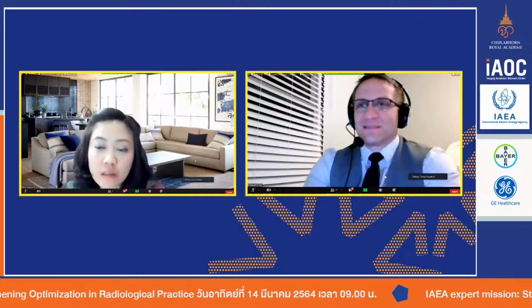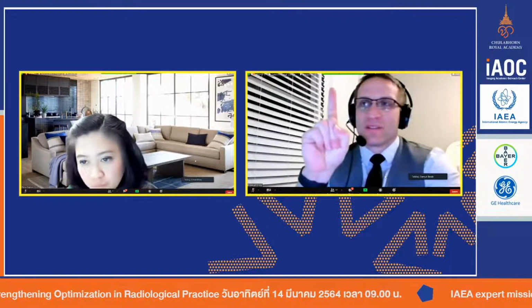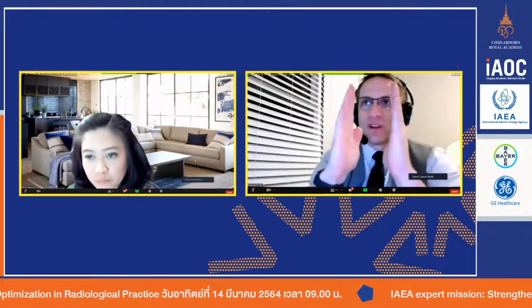So if they order a CT of the chest and thoracic spine, you scan the patient one time and you have the display image for the chest and also a display image for the thoracic spine. Is that correct? That's correct. So in that case, you can scan once, but you reconstruct normal.